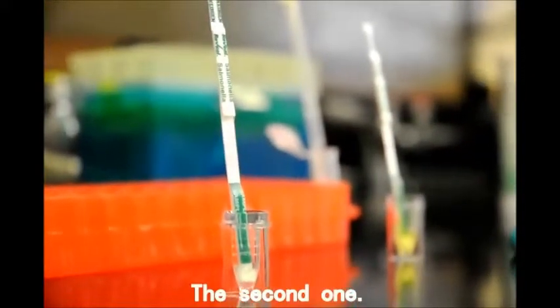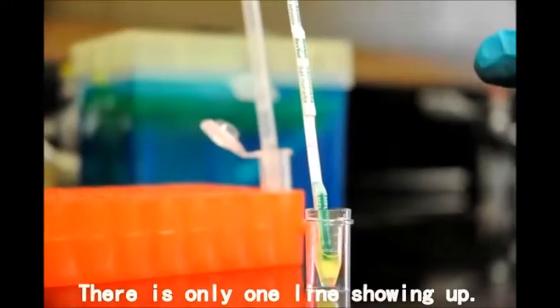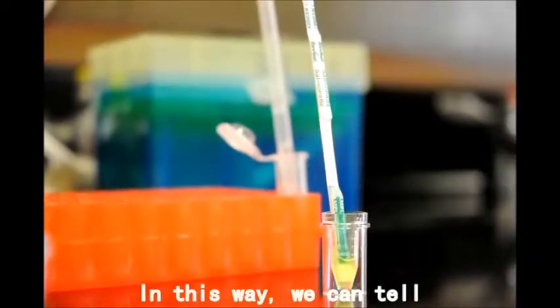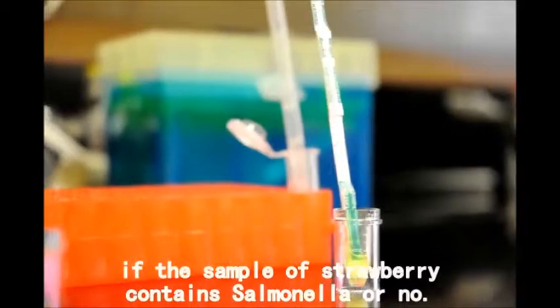The second one shows only one line — the control line. So this is negative for salmonella. In this way, we can tell if the strawberry sample contains salmonella or not.